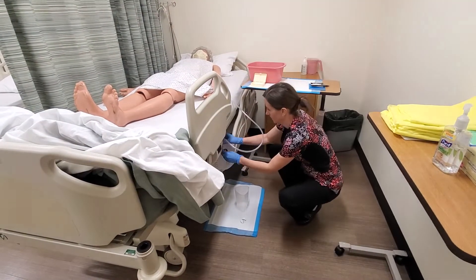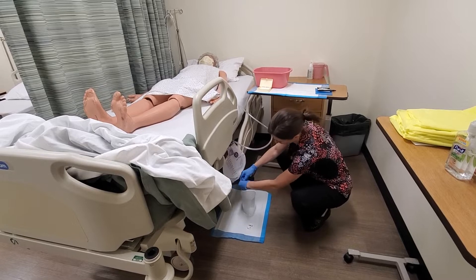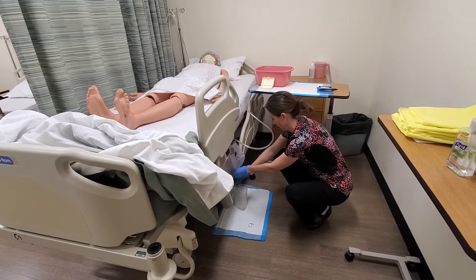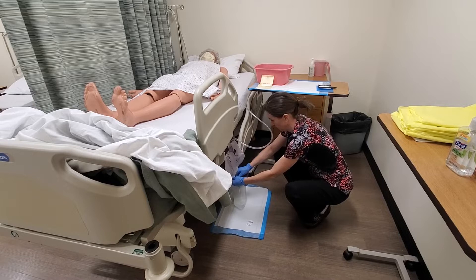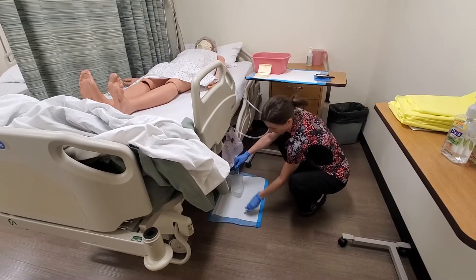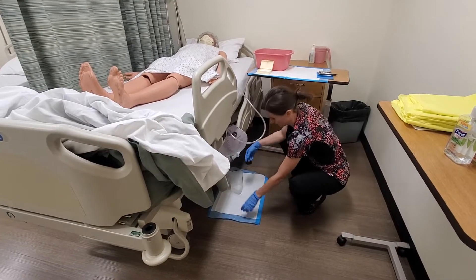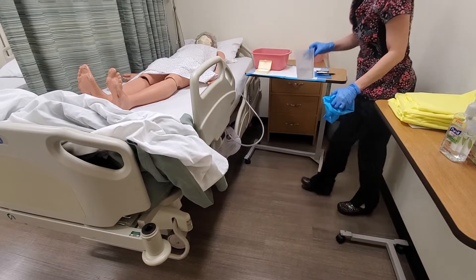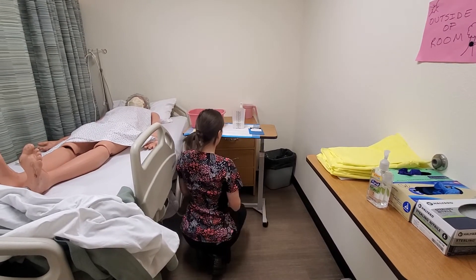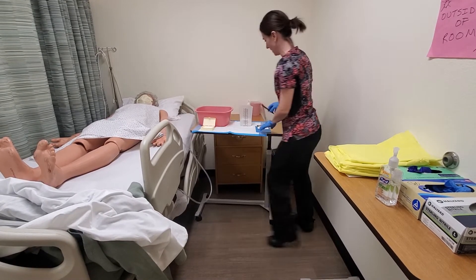I have my recording slip ready. I'm going to make sure at no time the drain touches the graduated cylinder. I'm going to empty the drain completely, making sure all of the urine is out, then close it. I'll wipe the drain before putting it back. I'll lift the graduated cylinder to a flat surface so I can be at eye level for my measurement. I have 325 milliliters of urine. I'm going to document that on my recording slip.